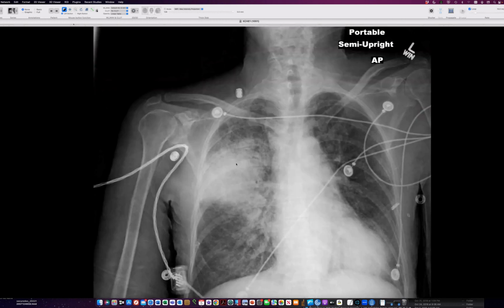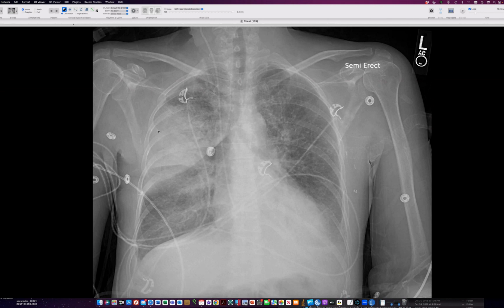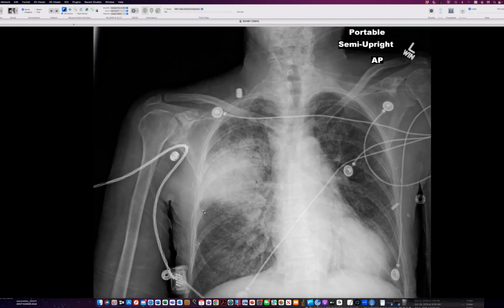So this person had fever and cough, and has this dense, compact pneumonia in the right upper lung, and then with time the margins began to fuzz here and it is probably spreading into the tissue around it, but it presented as a fairly compact and round lesion like this on this outside imaging. So we always think with something compact like this that it's worrisome for fungus, and when it's this big and grows fairly fast, you worry particularly about mucor. So if this were a diabetic person, you'd certainly worry about mucor, or some immune compromised person besides diabetes, like chemotherapy or something.